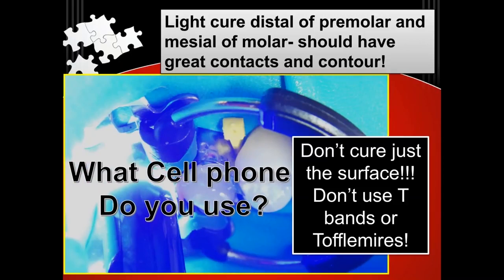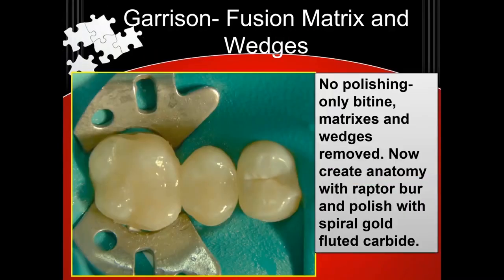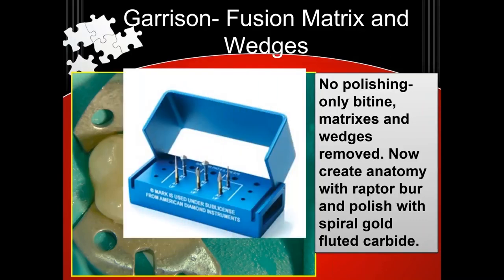I don't want to be part of that 80% of undercured posterior composites. And you just cannot do that with a T-band or Tofflemire — you have to leave them on. With a sectional matrix, you can peel them back and get that done. When people say 'I still use T-bands, I still use Tofflemires,' I ask what cell phone do you use — do you still carry a bag phone? That's really old technology. T-bands and Tofflemires are dating you. That was okay for amalgam, it's simply not okay for resin-based composites. So here, all I've really done is put a little anatomy in with a Raptor, taken off the matrices and wedges. You see there still isn't any bleeding, and you see how nice and tight the contacts are and how great the contours are. Then you can just polish a little bit using a Raptor kit, and I use nicely shaped carbide spiral gold-fluted carbides for going in interproximally.